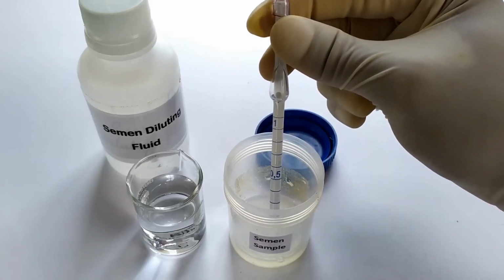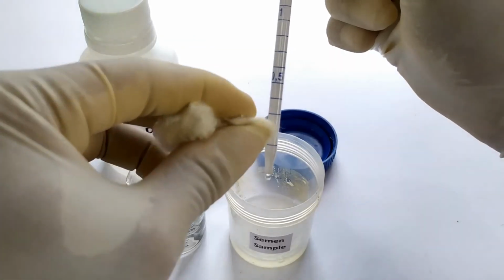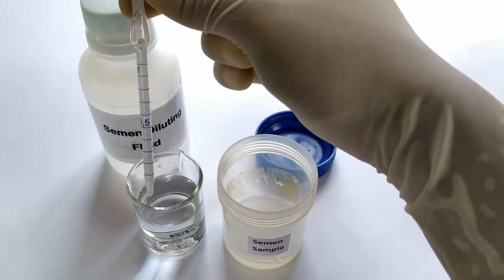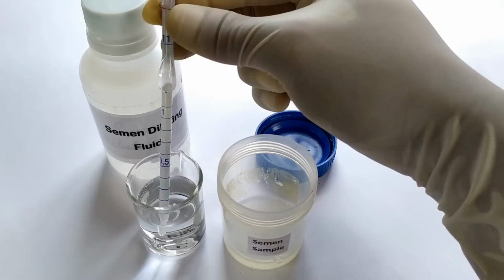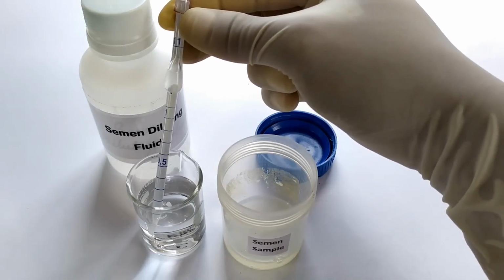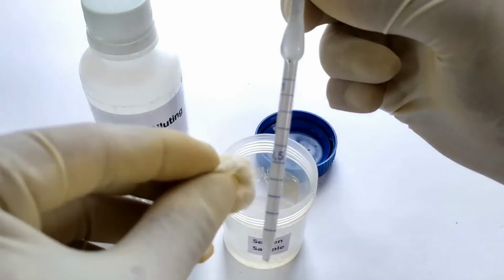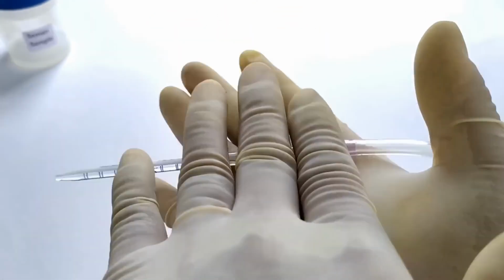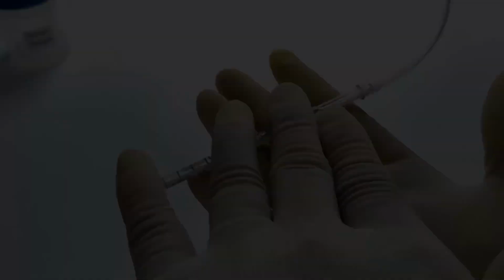Now draw liquefied semen sample till the 0.5 mark of the WBC pipette. Then draw the semen diluting solution until the 11 mark on the pipette. Gently wipe off excess fluid from the sides of the pipette tip. Now place the loaded pipette in a horizontal position and gently mix the contents for a minute or so by rotating the pipette between the palms of the hands.